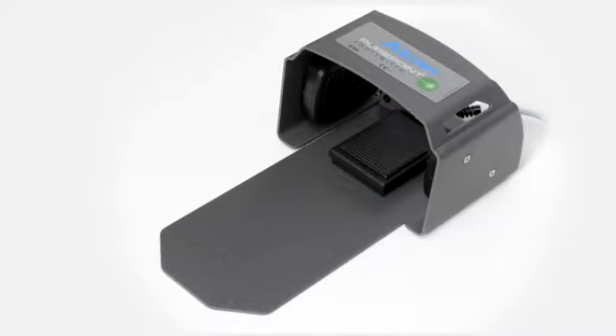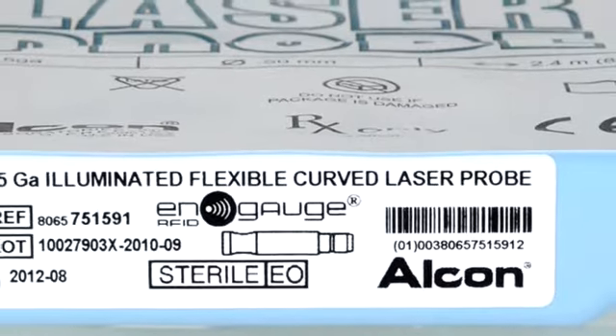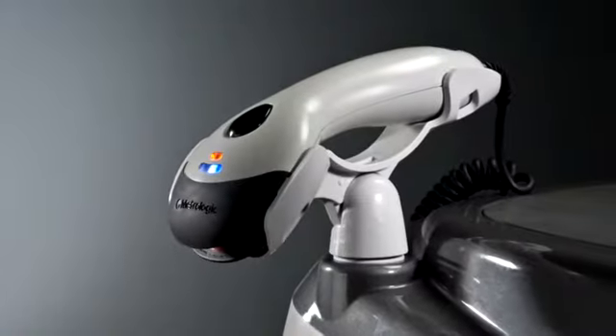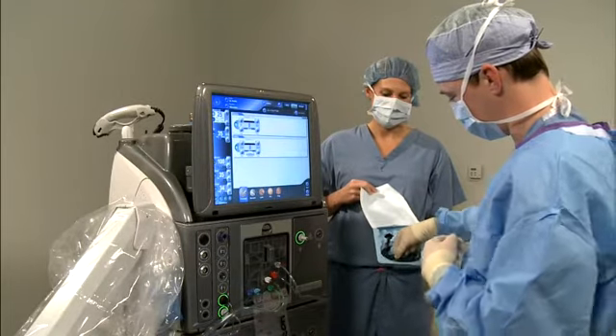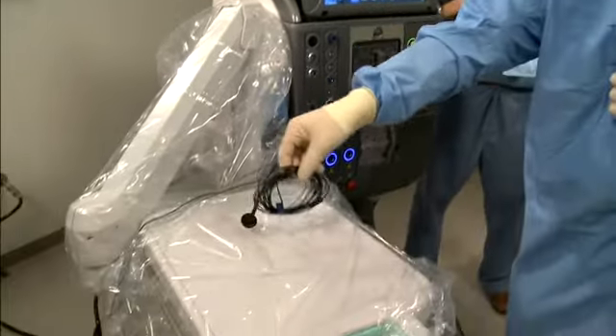We will first discuss the endoprobe laser delivery device. Each Alcon product pack has a barcode located on the labeling. Before opening a laser probe pack, scan the barcode on the barcode scanner. After scanning, peel the lid from the pack and aseptically transfer the components to the sterile field.